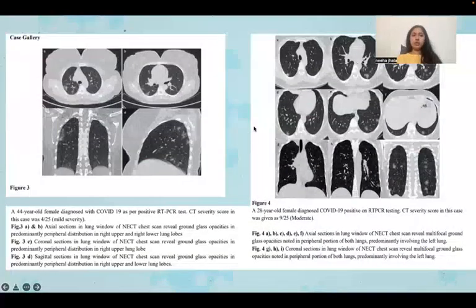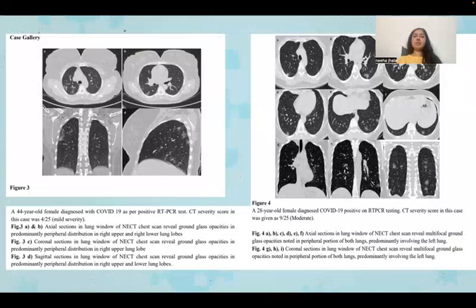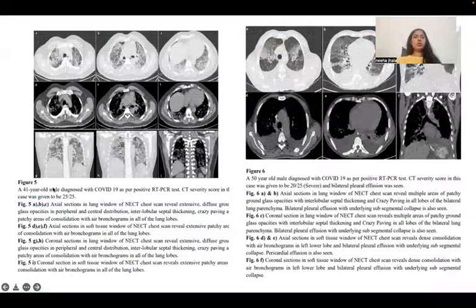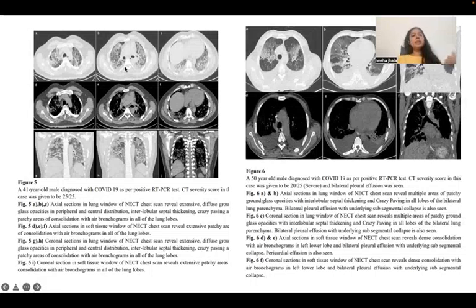In the case gallery, the first case in figure three is a 44-year-old female, an RT-PCR diagnosed COVID-19 case with a severity score of 4/25 — mild severity — showing ground glass opacities on coronal and axial sections. The second case in figure four is a 28-year-old female with a CT severity score of 9/25 — moderate category — showing ground glass opacities on coronal and axial sections. The third case is a 41-year-old male with a CT severity score of 25/25, where all lobes of both lungs show ground glass opacities with interlobular septal thickening and crazy paving pattern.